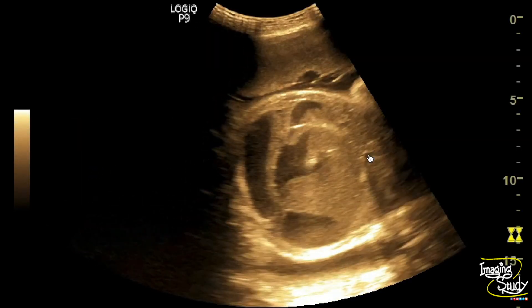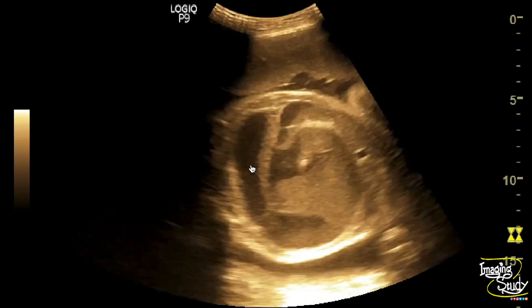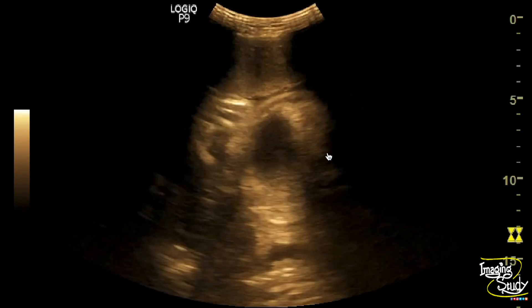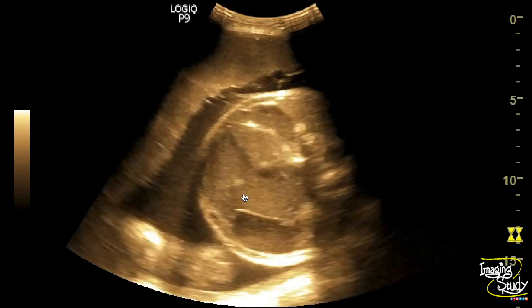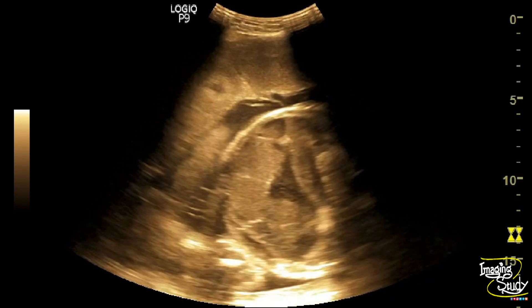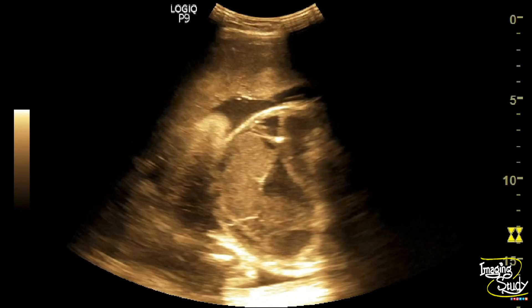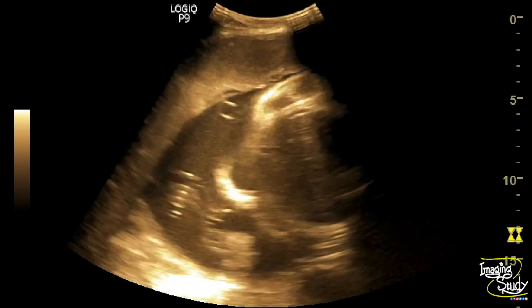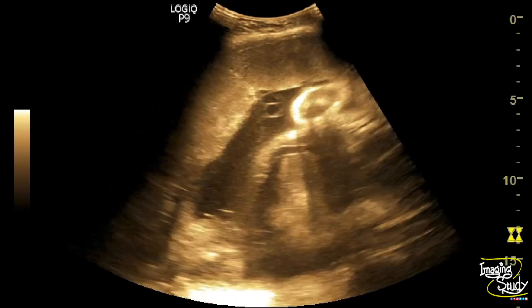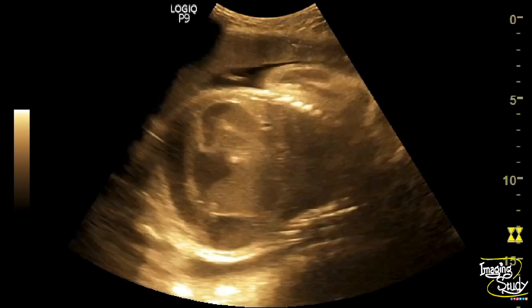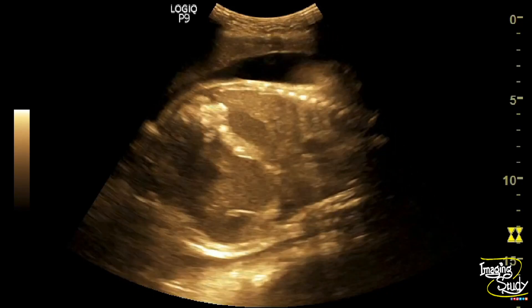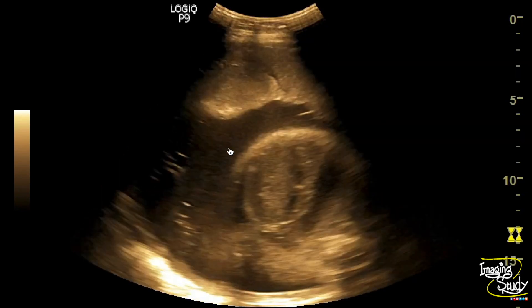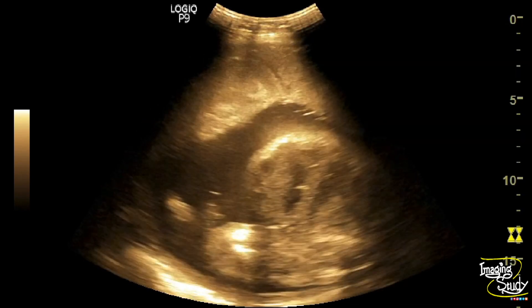Here you can see the fetal abdomen showing multiple dilated small intestinal loops with hyperechoic debris within these loops. There is no visible peristalsis. You can also see a hyperechogenic bowel segment — this is not only echogenic bowel but also calcification of the peritoneum.